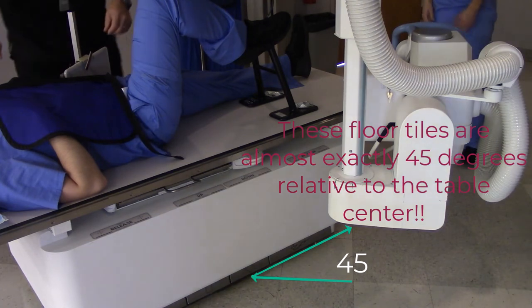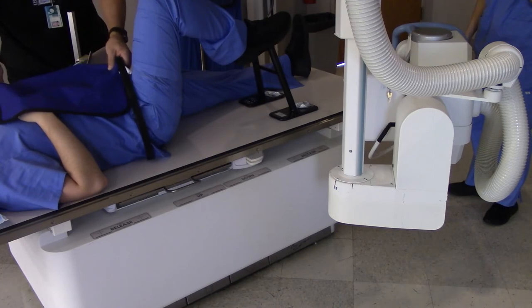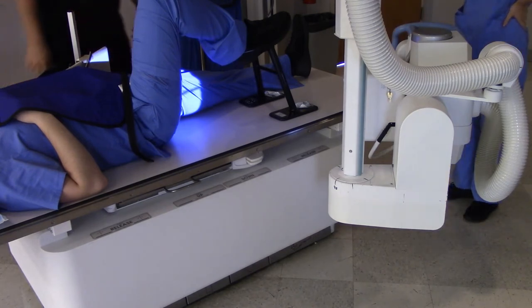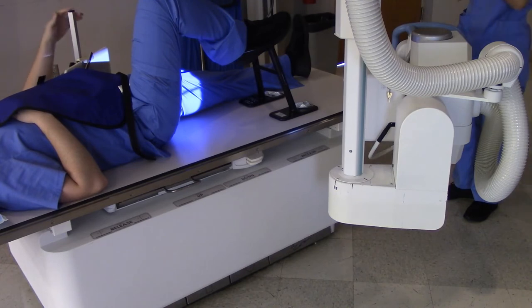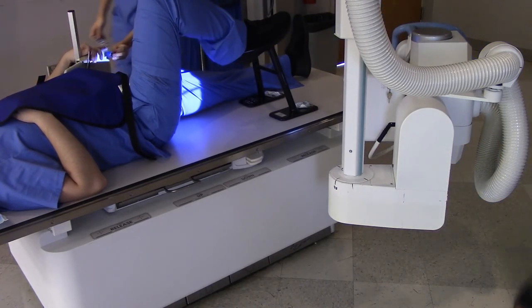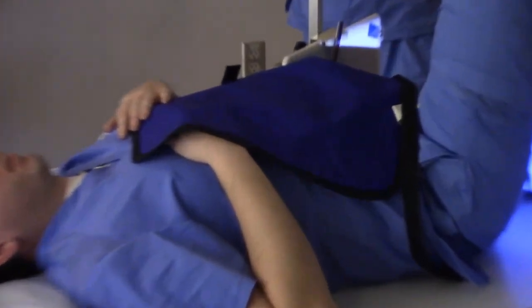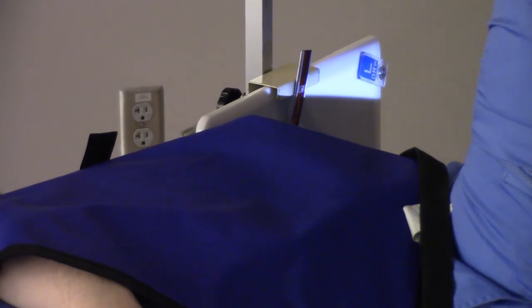Now Ms. Delaney is doing something a little dangerous. She is putting this thing... I'm just going to tuck this over to the side. I want to make sure that that lid doesn't show up in the image. There you go. Now all we need is a marker on there. This is going to be a left marker because it's the left leg that's the one of interest. You can put your marker anywhere on the image as long as it is out of the patient's anatomy, so what you got there is fine. That's going to be in the light field.